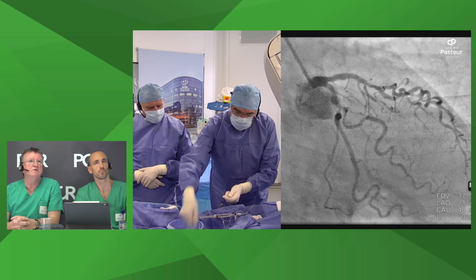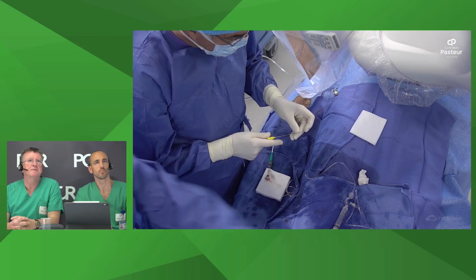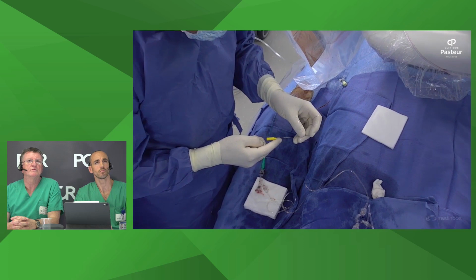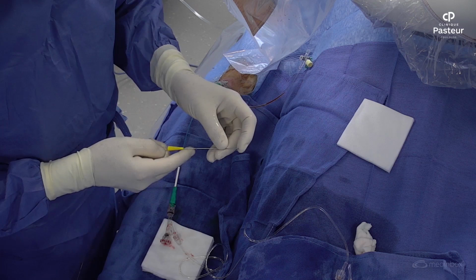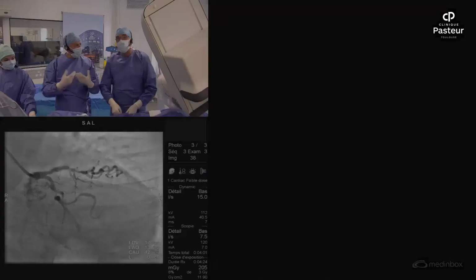Okay. And you wouldn't routinely do an arm angiogram. You'd reserve that for experiencing any particular issues with tracking your equipment. Okay, that's a good point. In our usual experience, we are not doing systematic angiography when we do a radial angioplasty. Only if we have any resistance. If you experience any resistance when you advance the wire or the guiding, never force. Do an angiography and understand what the problem is.